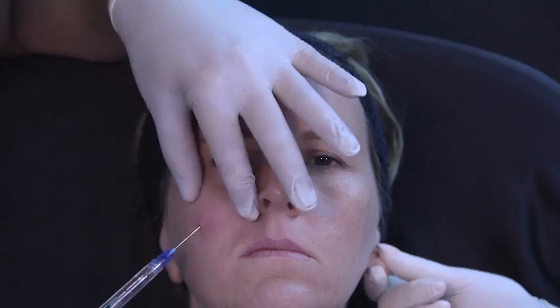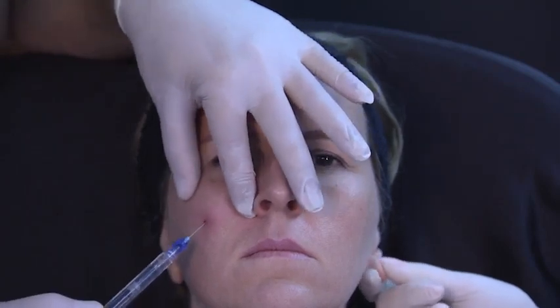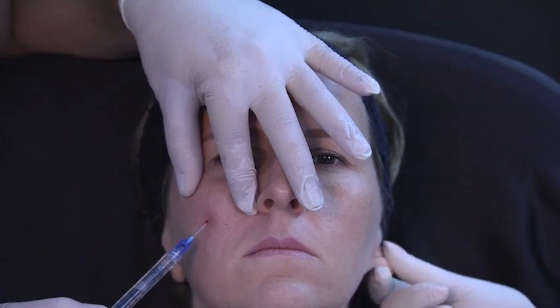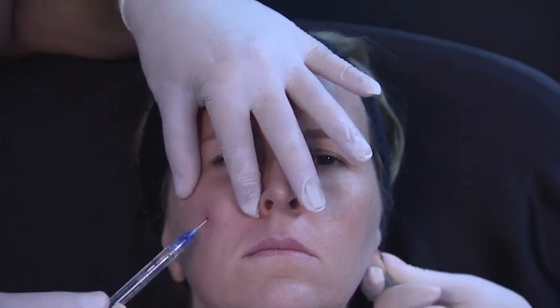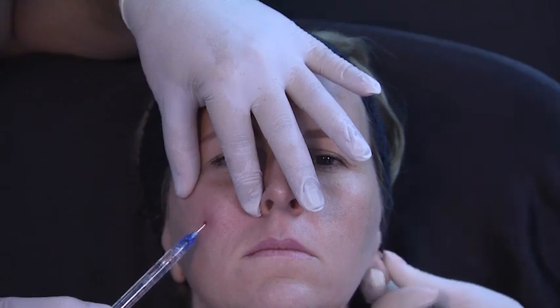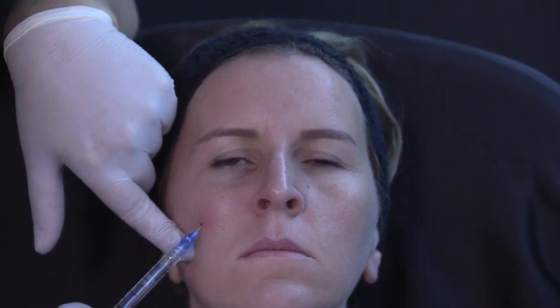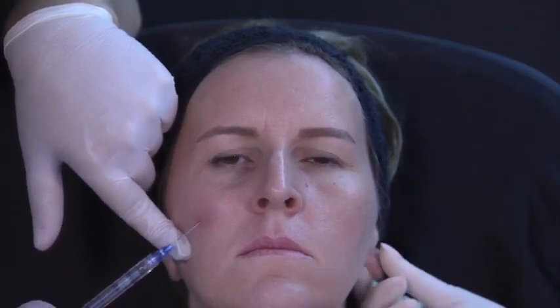So Frank, do you have the holotome there? Not yet, you can continue. Right. So I am injecting Restylane Volume because the priority here is to volumize this area. And I also want to show you the indirect improvement of the tear trough. Imagine that in our clinics, we don't have enough budget, or the patient doesn't have enough budget for all the treatment. The first thing we have to do when we want to improve the tear trough is to treat the midface.